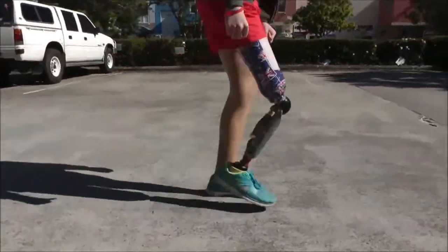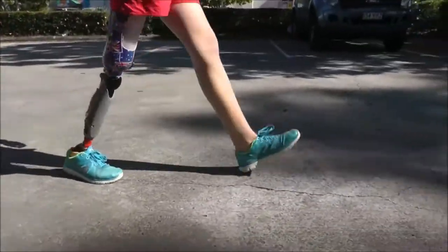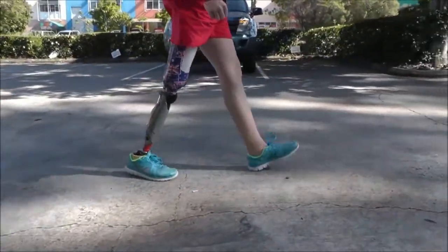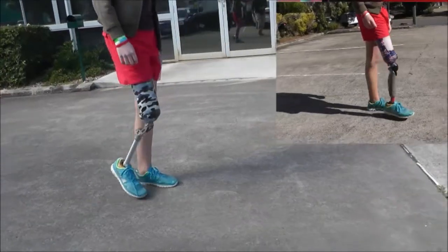This is a patient walking, and I want you to notice how the knee performs in speed. And we're also going to see his knee that he had prior and how it behaves with speed.